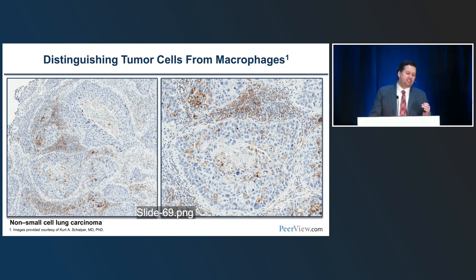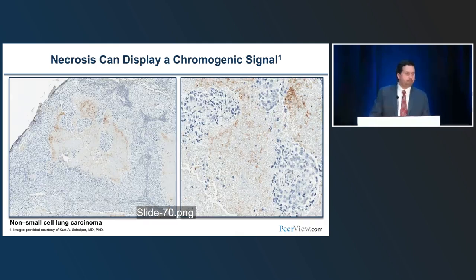In general, the cut points are relatively loose, from 1% to 50%. So putting the case within those thresholds is not a problem, but it can be in the context of 0 to 1%, because 1% essentially means any positive cell.